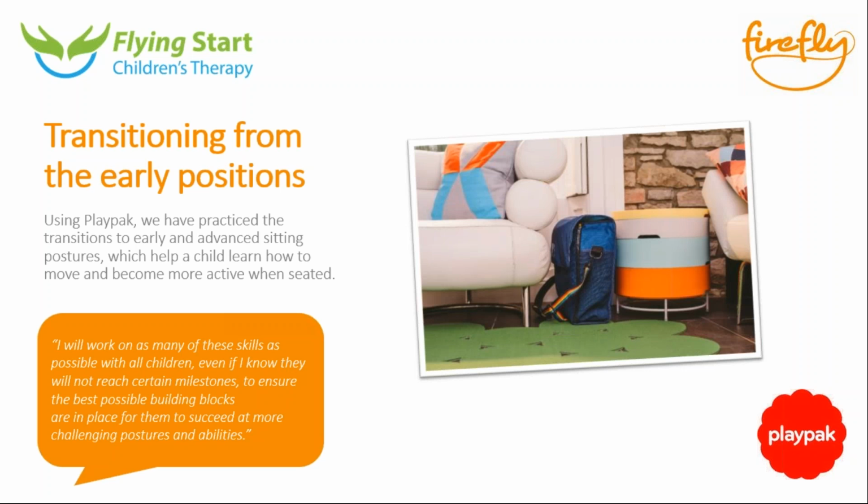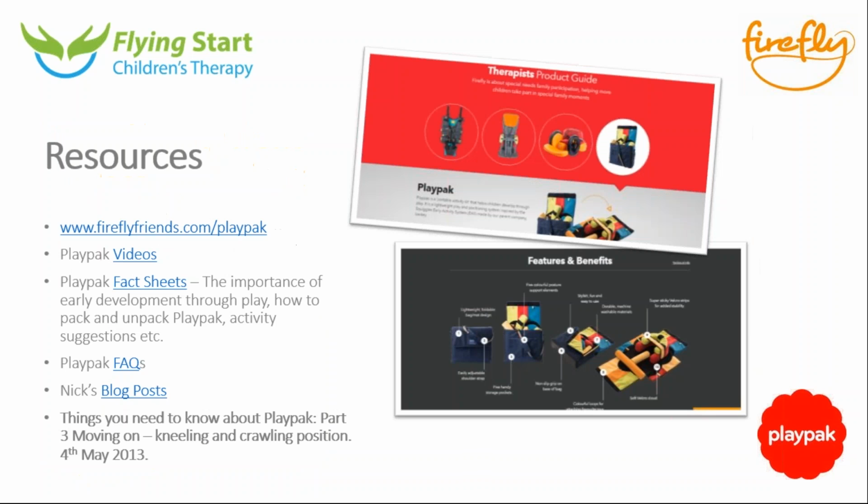Actually, using Playpak, we've practiced transitions in early and advanced sitting postures, which can help a child learn to move and become more active when seated. Yeah, so it's just leading through what I said, in that we do work on all sorts of skills, starting with laying and then progressing our way up to sitting. But we work on them all at the same time, and we progress. Sort of covered all of that.